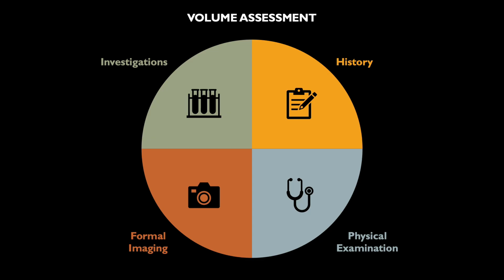When approaching a patient's volume status, I use the words volume assessment and not volume examination deliberately. This is great advice I got from a former mentor of mine. You should really approach volume status as a holistic assessment, integrating multiple findings from all the clinical tools at your disposal. This talk will focus on the integration of POCUS into our approach, but the concept of assessing patients holistically is important to keep in mind whenever you are trying to decipher volume status.